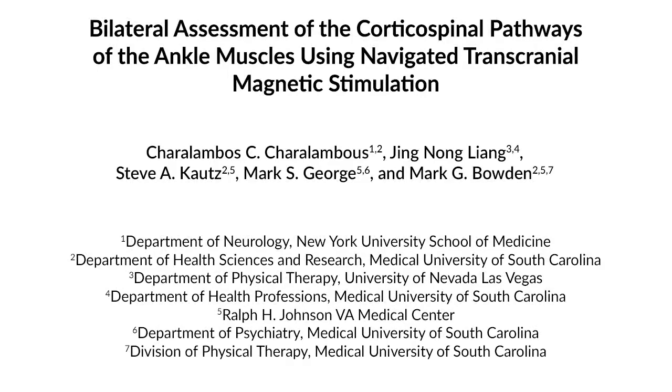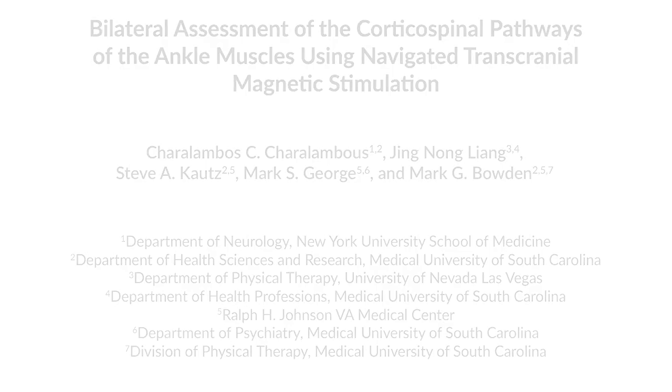This protocol is critically important because it standardizes an approach for the very difficult task of detecting motor-evoked potentials in the distal lower extremity muscles. The main advantage of this technique is that it consolidates the literature associated with lower extremity stimulation, which often focuses only on the tibialis anterior and uses a variety of techniques.